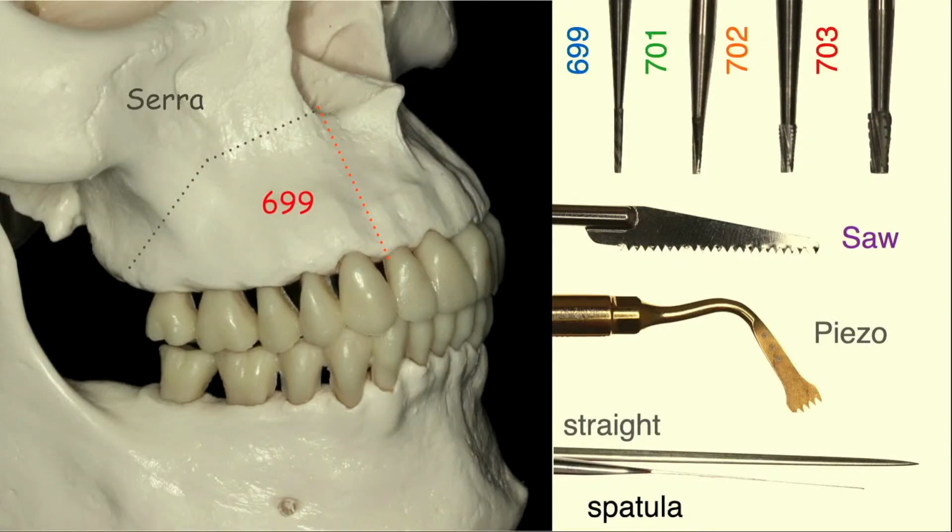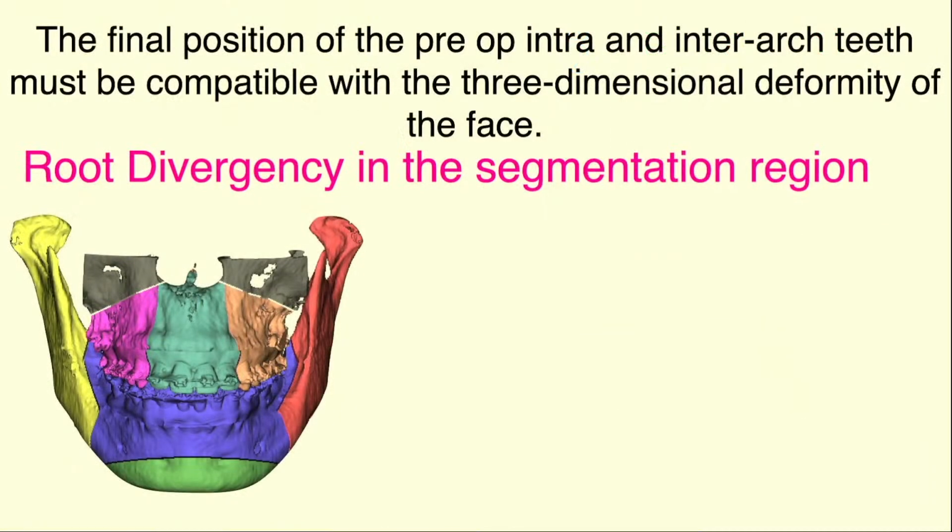And I have all these instruments to help me, especially the piezo saw, with which I have to be very careful not to touch the soft tissue and to take care of the palate, but it's very safe. So the only instrument that I use today is the piezo saw to do the split, to do the segmentation in the maxilla. I don't use saws and burs anymore, just the piezo.